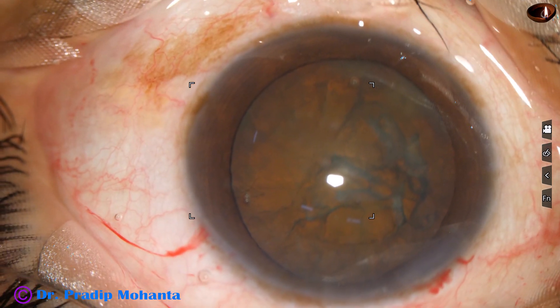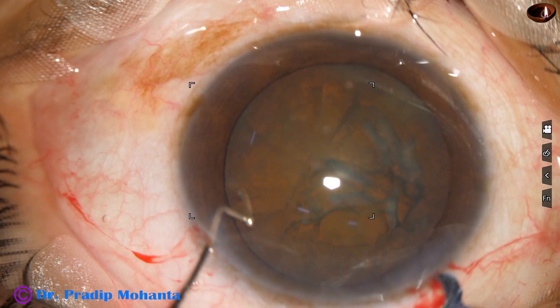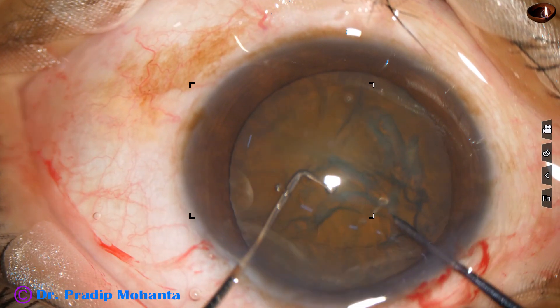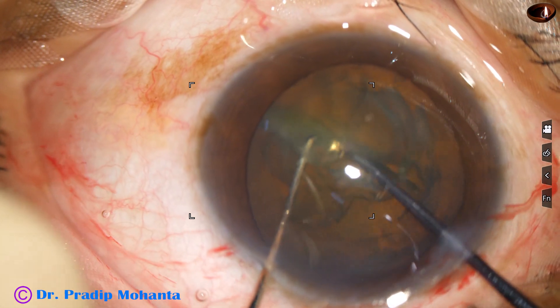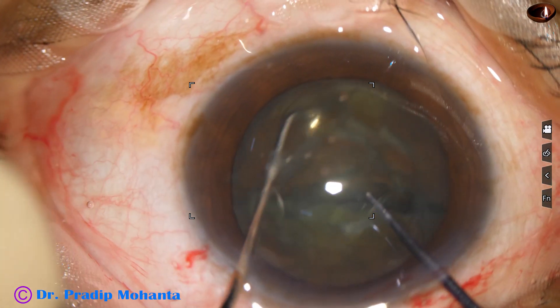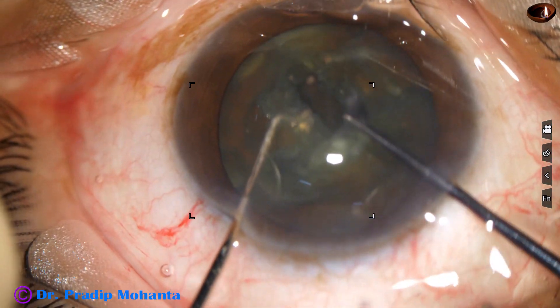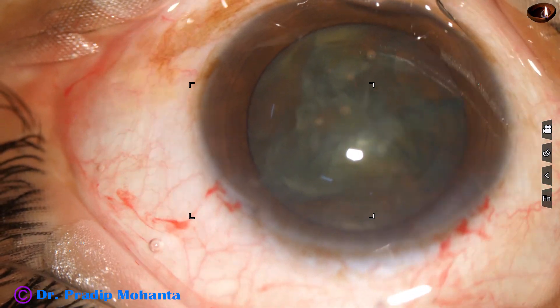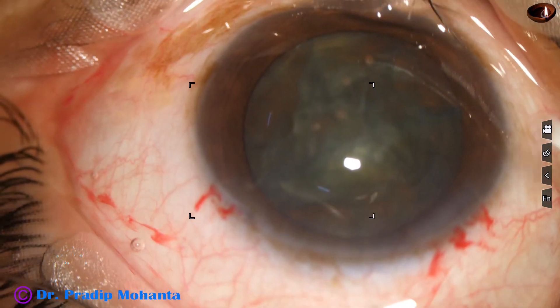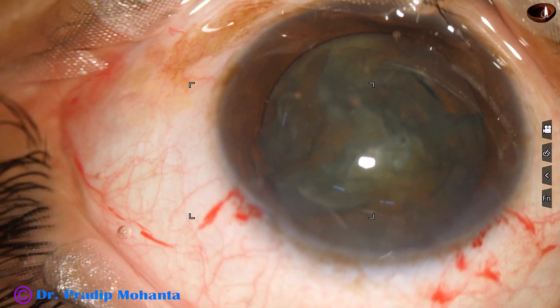This is a pre-chopper designed by Dr. Suhail Irfan Khan. This pre-chopper works nicely in my hand, and I could divide the nucleus into two halves. One hemi-nucleus has been divided into two fragments, so we have got three pieces.